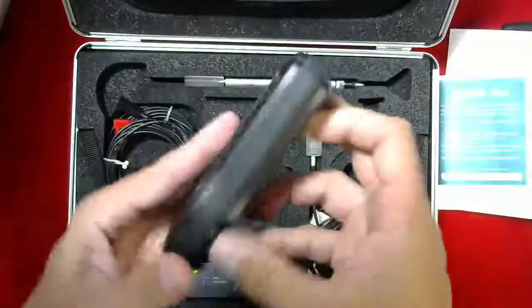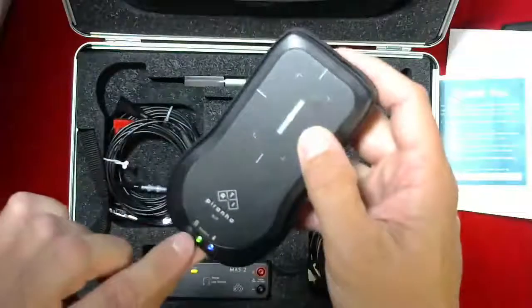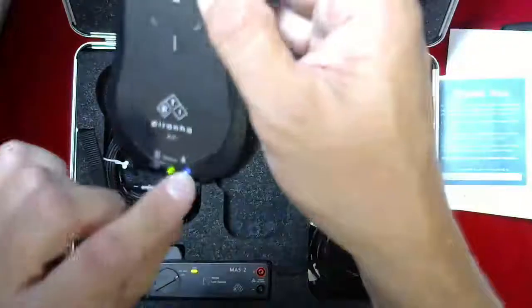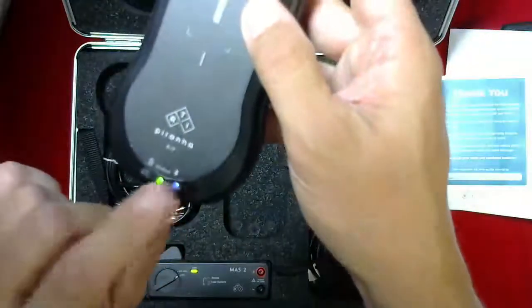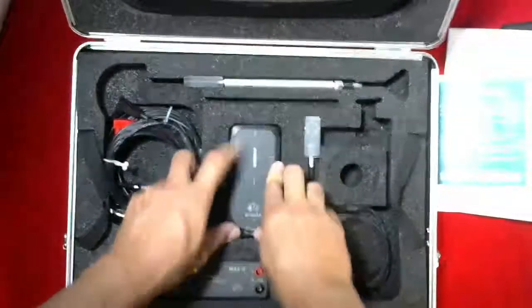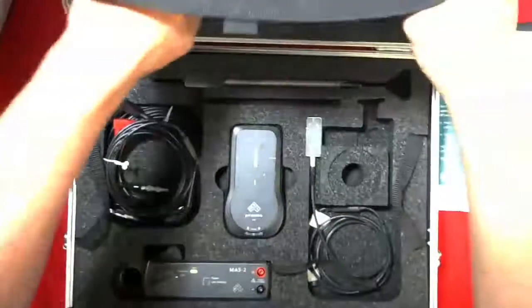The Bluetooth — when you turn it on, it goes through a power check, and when you see the blue light here, that means it's communicating, sending out the Bluetooth signal for the software, so that when you turn on the laptop it will communicate with the device.